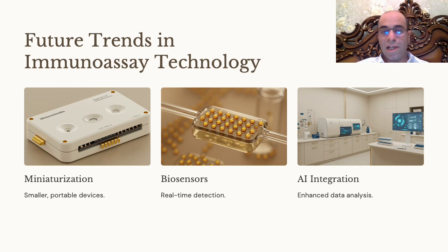Okay, machine learning algorithms automating result interpretation and reducing false positives are the main features of AI integration. Predictive analytics, identifying testing anomalies before equipment failure. These are all what AI can do for us in the future.